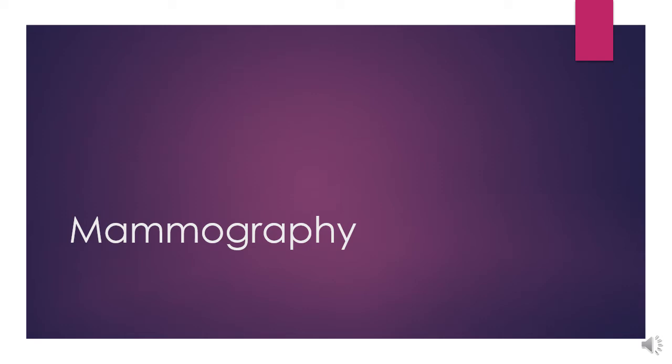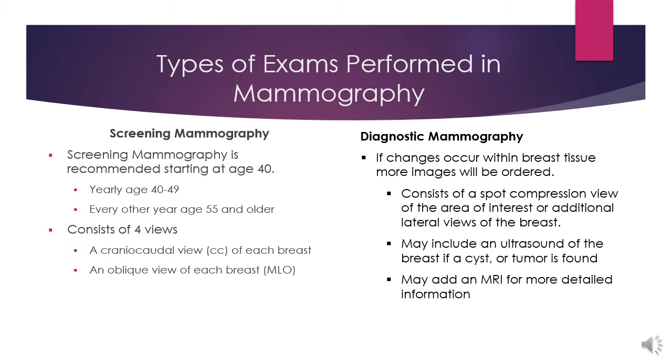In this presentation, we're going to be talking a little bit about mammography. There are two different types of mammograms that are performed in the mammography department. There's a routine screening mammogram that is performed starting at the age of 40.